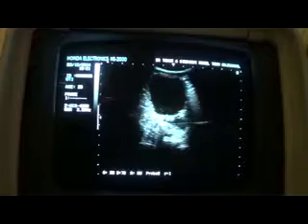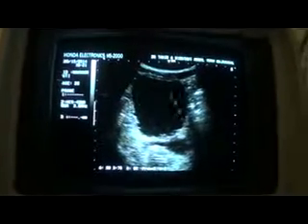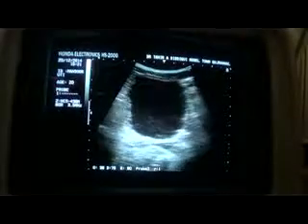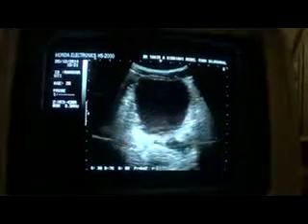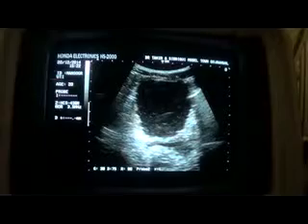Okay, now see the wall of the urinary bladder. Now this part of it shows you ascites again. This is the urinary bladder. Note the walls of the urinary bladder. I am manipulating the knobs to show you. See the hypertrophic trabeculation of the walls. This is the anterior wall.